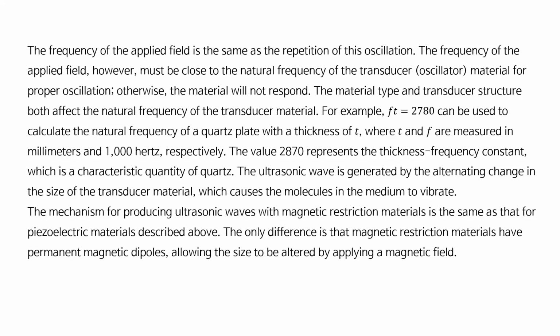The frequency of the applied field is the same as the repetition of this oscillation. The frequency of the applied field, however, must be close to the natural frequency of the transducer material for proper oscillation, otherwise the material will not respond.